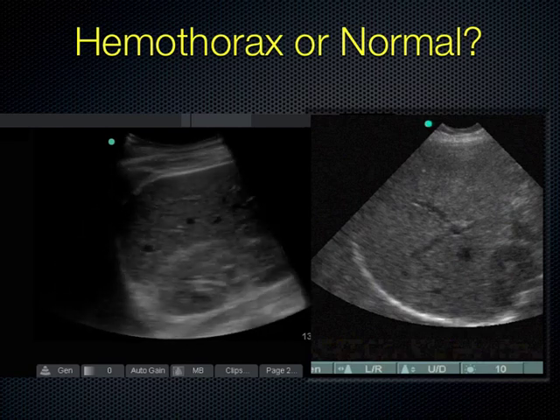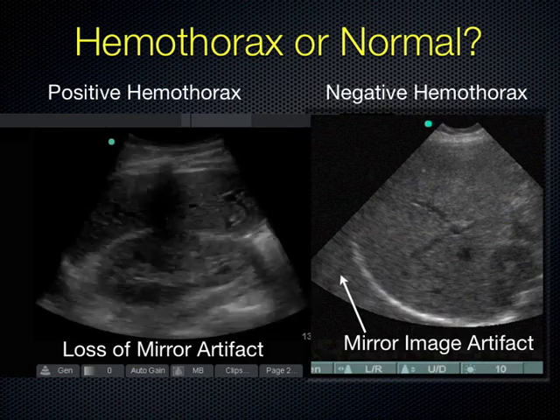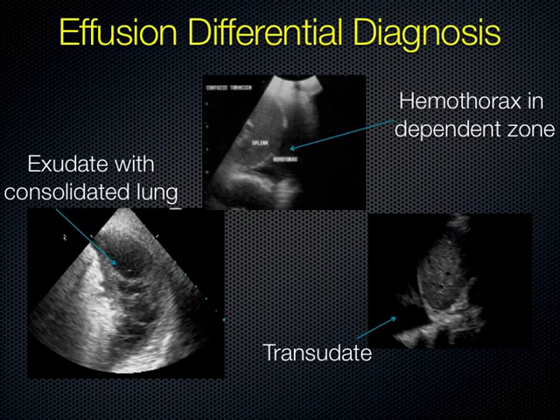I've mentioned transudative versus exudative effusion and hemothorax. Sometimes you can tell the nature of the effusion, and it guides your management. For instance, if you're thinking about putting a very thin needle into an effusion to drain it, in a thoracentesis, you might not choose to do that if you have something that looks very thick with fibrinous loculations or blood in it, because you need to manage those differently. So it does help. It's not diagnostic. You should never say this is transudate versus exudate based on what the ultrasound looks like, because you need to send it to the lab to be sure.